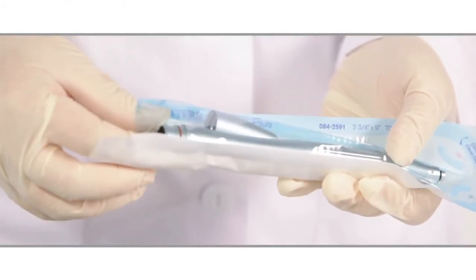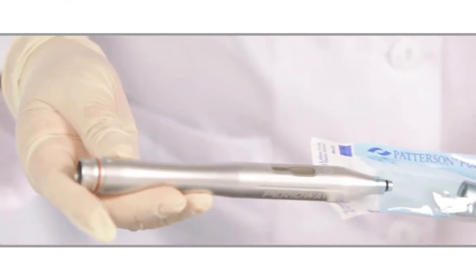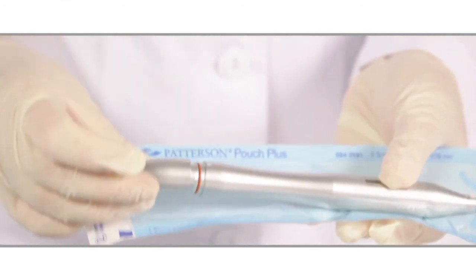After sterilization, check that the cycle was satisfactory and that the outer wrapping and seals of the pouch are intact. If the pack has a process indicator that has not changed colors correctly, do not use the contents. Open the pack and return to the start of the cleaning process.